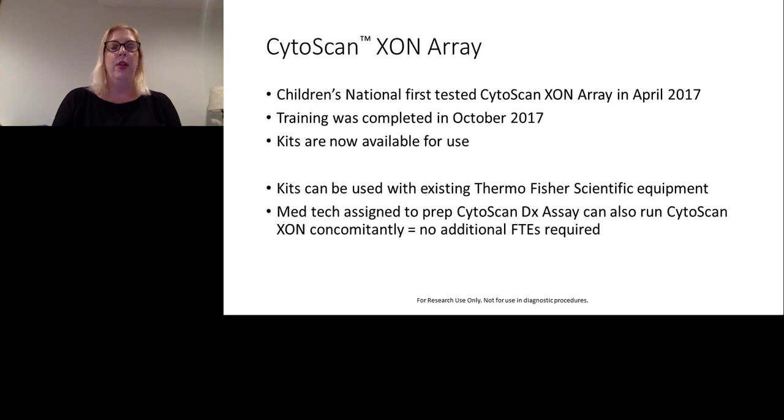And one of the really neat things that we were able to accomplish in our lab is that the medical technologist that is assigned to prep our CytoScan DX assay, which is run on a weekly basis, can also run the CytoScan XON concomitantly, which meant, at least in our laboratory setting, no additional FTEs were required to bring this additional test in-house.